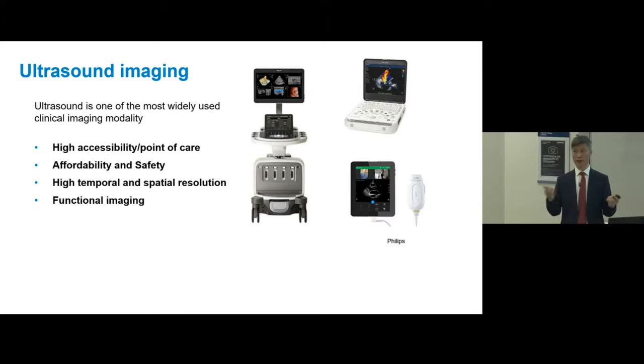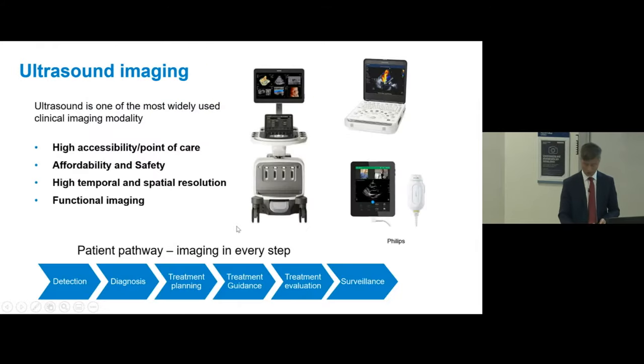I can tell you all day about how wonderful ultrasound imaging is. It's broadly used in the clinic already. It's super portable and accessible. It's a bedside point-of-care technology, it's affordable, with a superb safety record, and I'll show you very soon it can have very high spatial and temporal resolution, and it can provide functional information. So it's already integrated at every step of the patient pathway in the clinic, from detection, diagnosis, the different stages of treatment, and afterwards, okay?